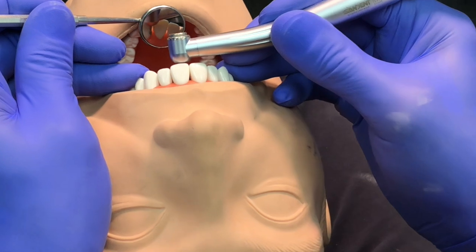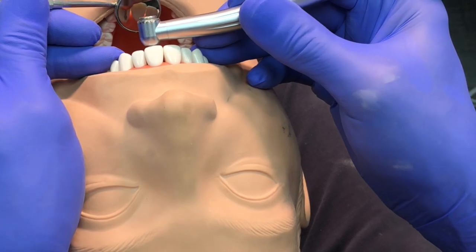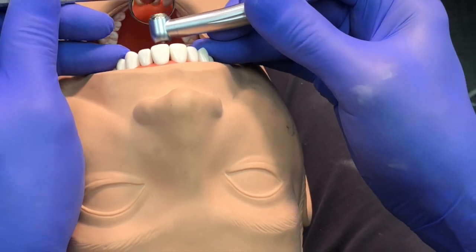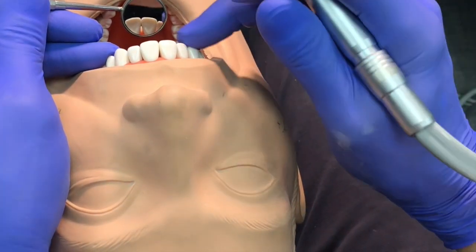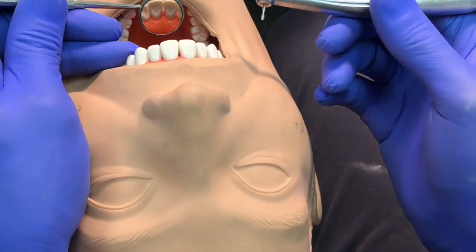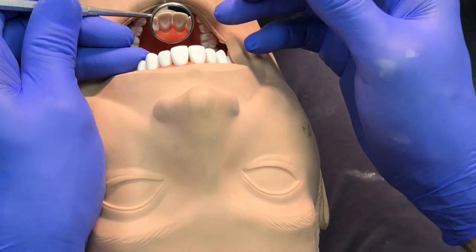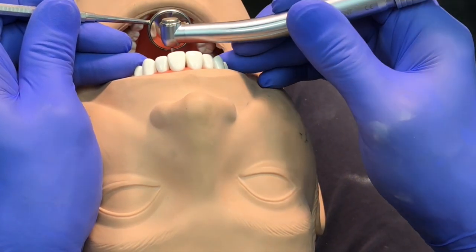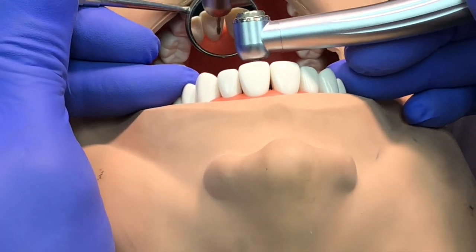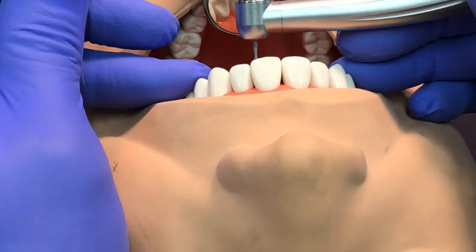It takes some time to get used to this, but it's very comfortable even though there's a lot of information in the view — my hands, the patient, the teeth, the handpiece, everything going on. All I'm interested in is the little view in the mirror. In fact, I'm not even going to see the whole mirror view because it's being blocked by the handpiece partially. I only get a partial view — and you know what? That's all you need.